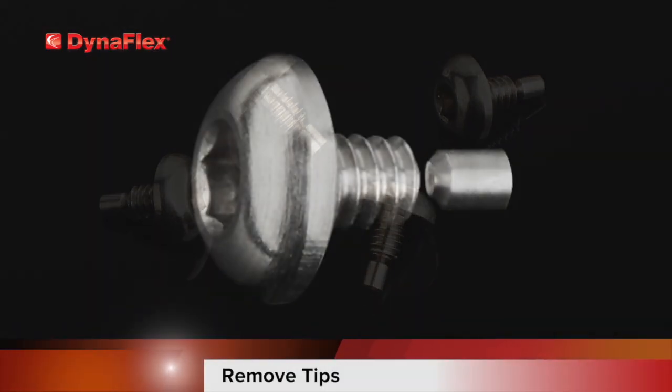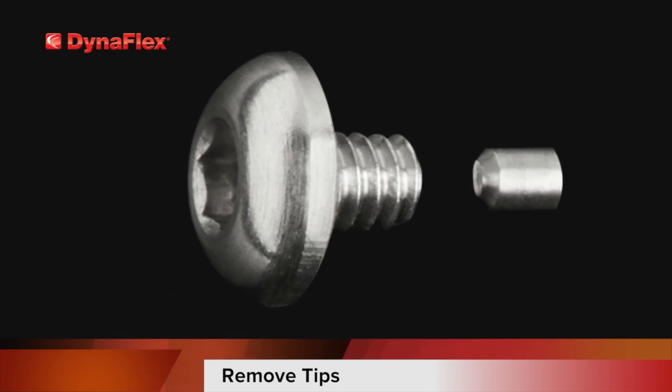Looking at the screws, you will notice that there is a tip that can be removed. Go ahead and remove this on the four screws that you'll be using in the mouth. I'll explain at the end of the video why you would leave these attached.